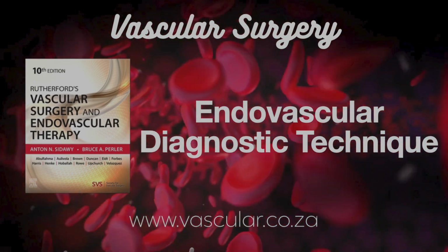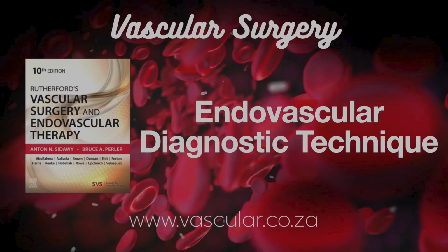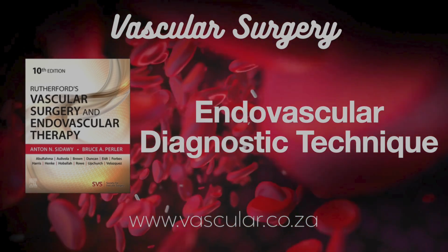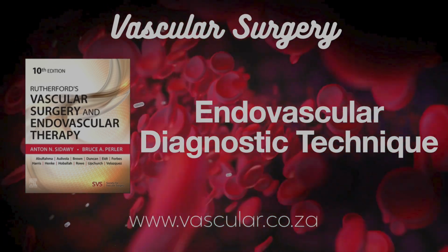How much contrast for that? Might do something like 8 mL per second for a total of 80 mL. It's quick, efficient. But downsides? Image quality can be variable. Differences in flow between legs, limited projection angles, contrast gets diluted further down.